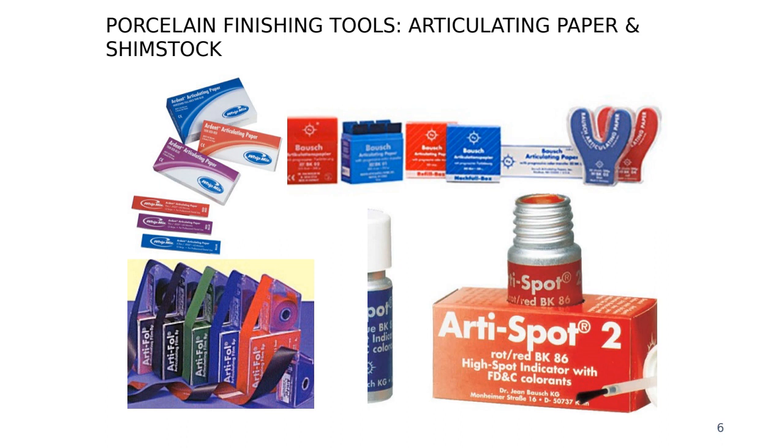Just because you did a perfect wax-up doesn't mean the final restoration, even a monolithic one, is going to be perfect. You still have to check. So how do we check this? We can use articulating papers, and we can also use markers. This is more like a paste that you can paint, and then where the mark is, you grind only in that spot.